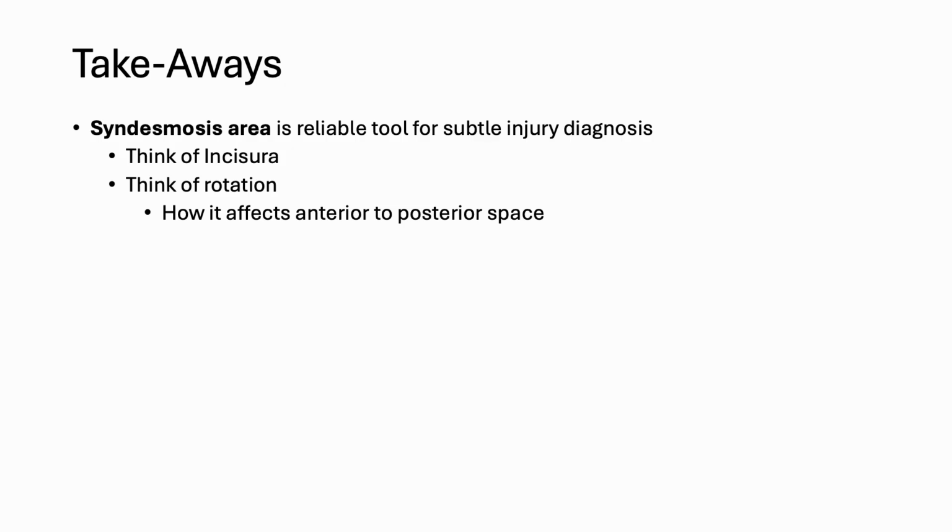I usually just do a TightRope or 2 TightRopes because I do center, so I know I usually am going to get a good alignment. So I have a low threshold on fixing isolated fibular fractures with a positive stress medial clear space widening. Or if I think there's any rotation on those x-rays, right versus left, I'll also get a weight-bearing CT scan to prove that.